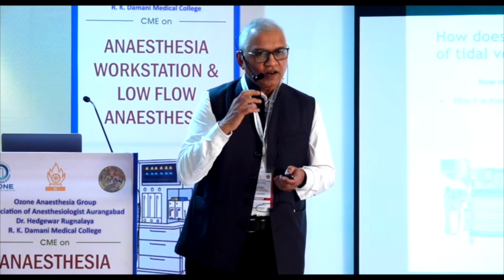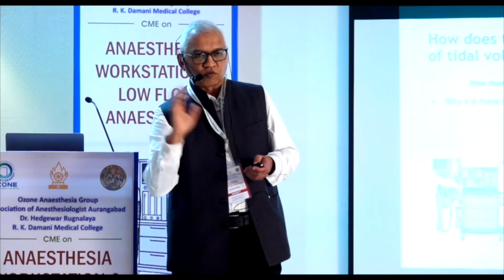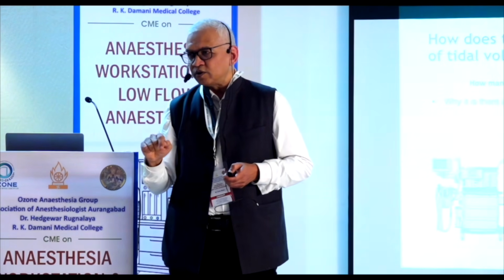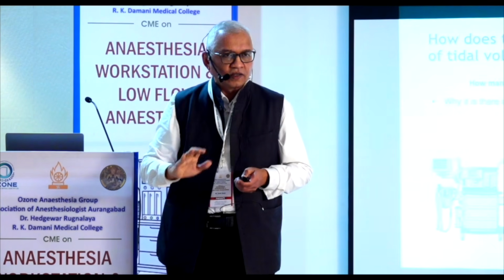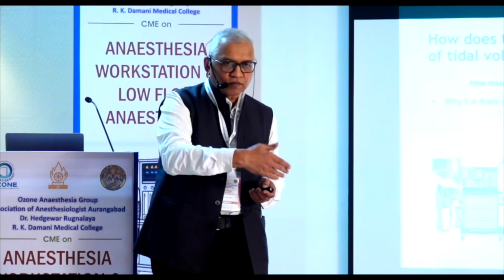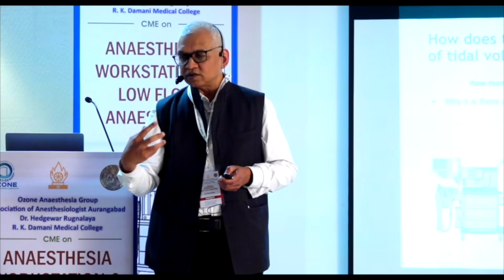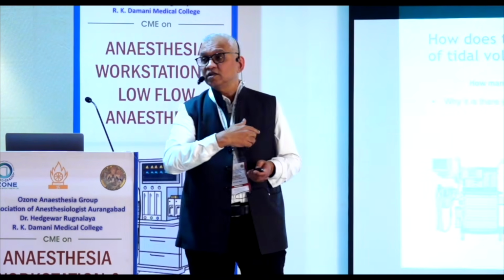Okay. When a heated vaporizer delivers a heated gas which is added to that particular flow, the temperature would be different. So the error can come. So the machine wants to identify that, okay, I am using DES now, the temperature might be different, and then it will sense differently. So if you are using Desflurane and one particular machine, you have to start DES compensation. The reason is that heating or temperature sensing is a technology which is used in such machines.